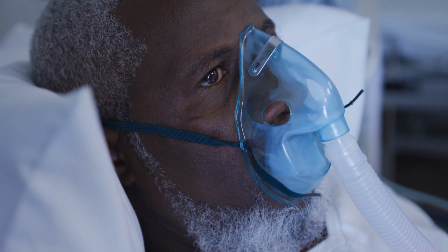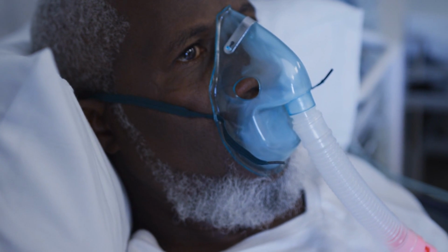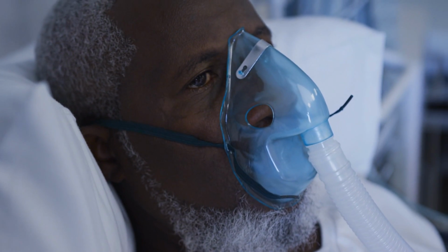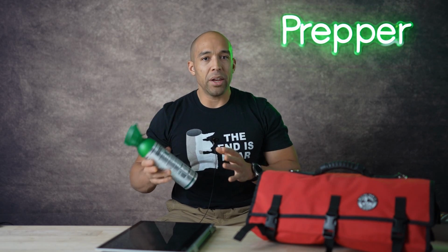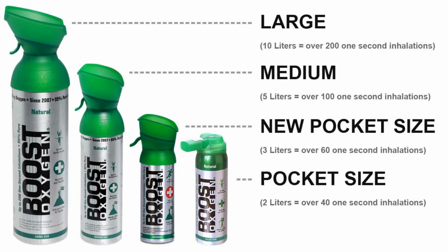This is not going to be sufficient for that, namely because that oxygen is 99.2%, and of course you have a lot more of it. For a person who has been hospitalized with the virus and is on oxygen, they're using about 1 liter per minute of oxygen. Now, this is just what I've researched, so don't quote me on that, but it's a lot more than this will ever provide.